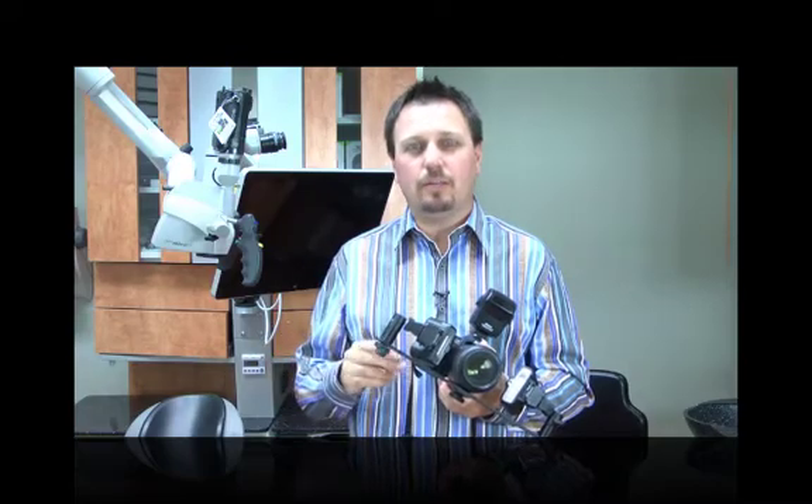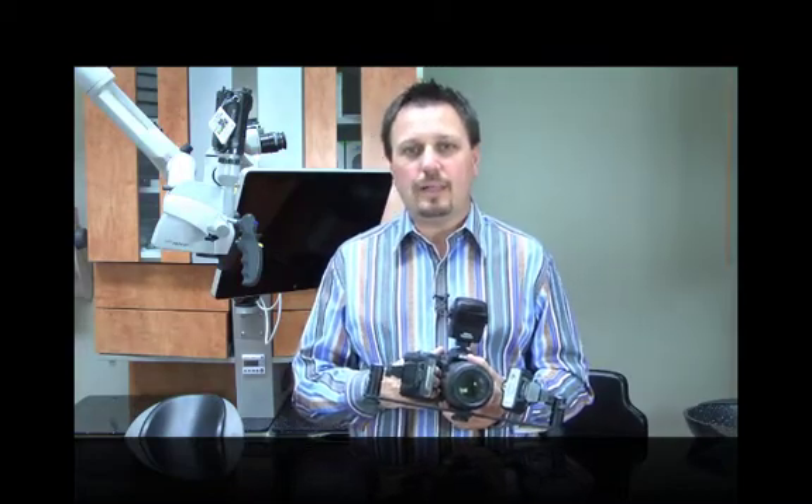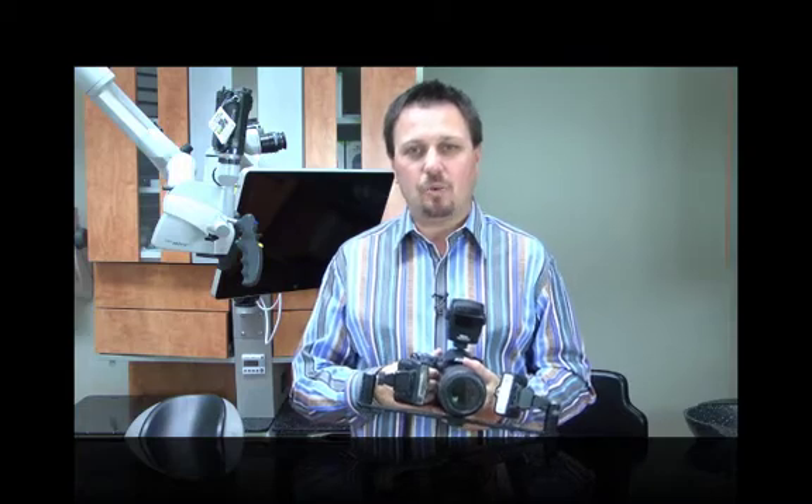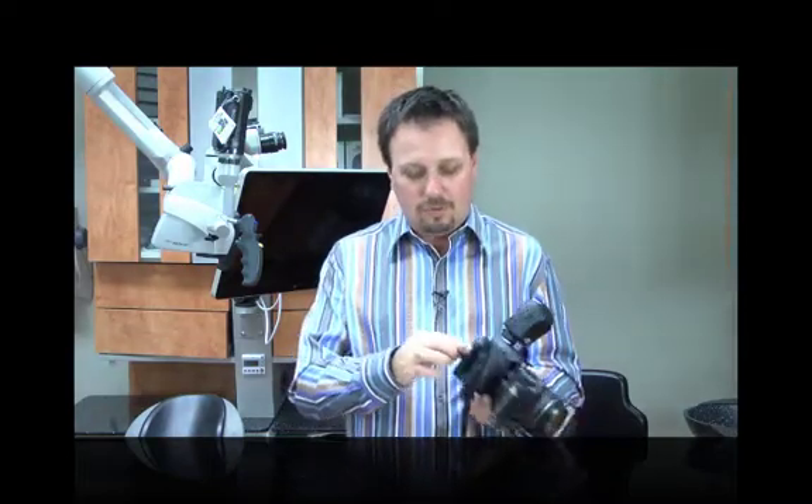A few features I found really interesting: the camera powers on very quickly, which is great for grabbing fast shots in both recreational and clinical settings. It has a 16.2 megapixel CMOS sensor — almost at a pro level — which provides excellent resolution for clinical photography. It also does ISO up to 6400, which is great for low-light vacation photography, and it has dual SD card slots.